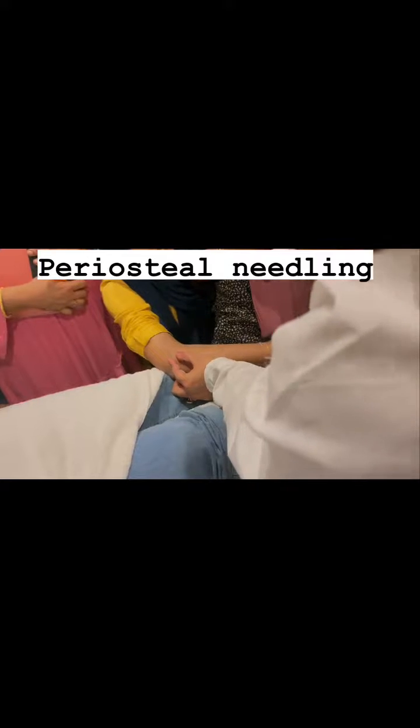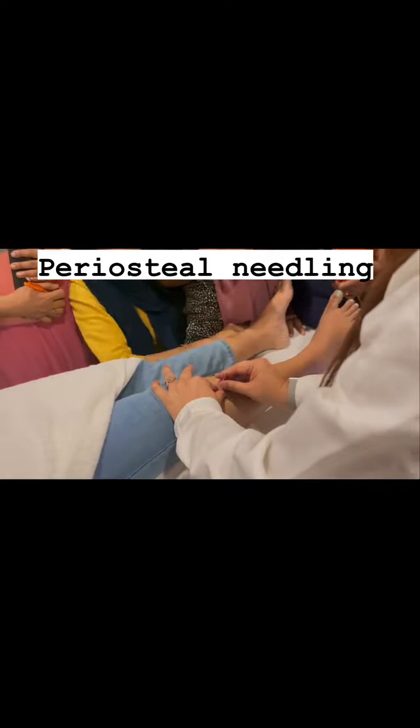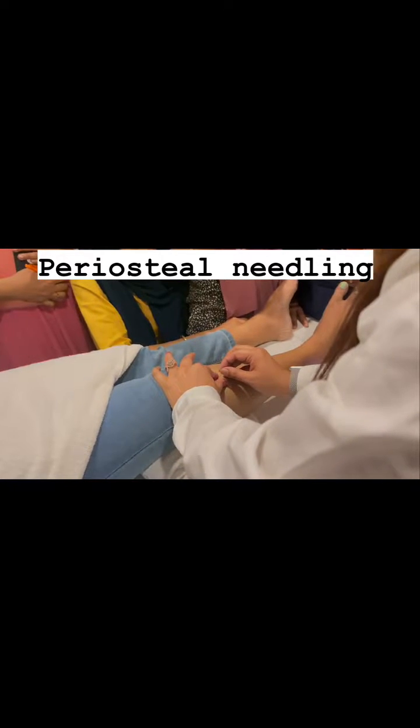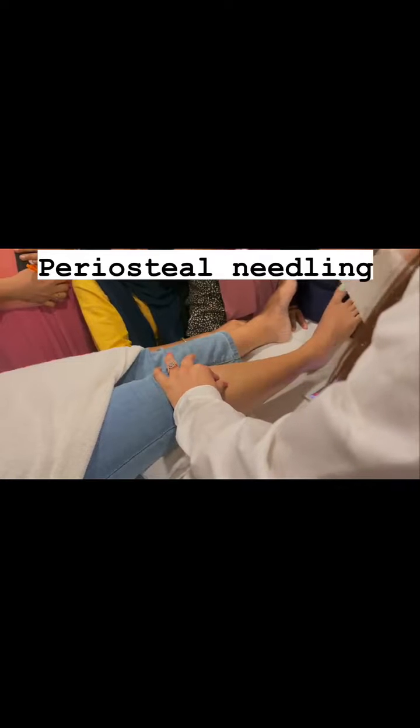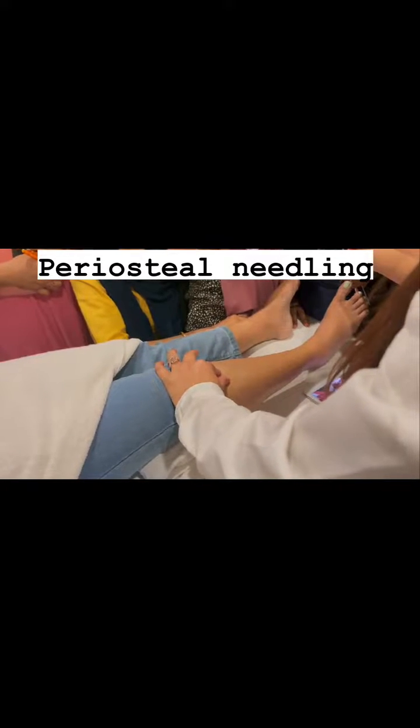Now the technique over the bone: insert the needle and peck, peck, peck — eight to ten pecks like this. It will feel like you are hitting on a table, a very hard feeling.